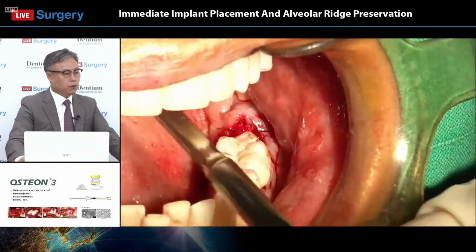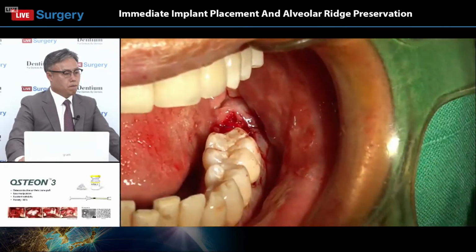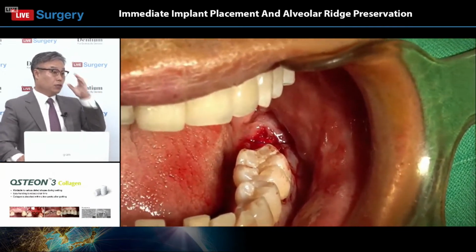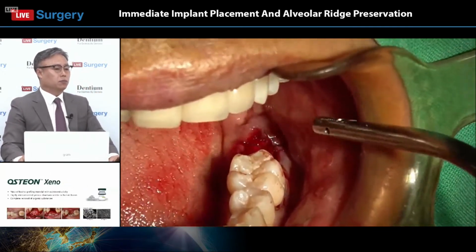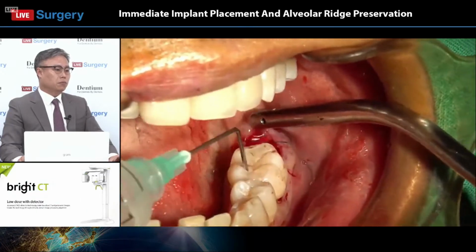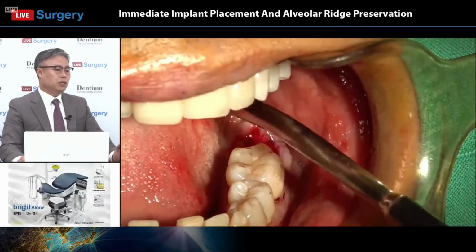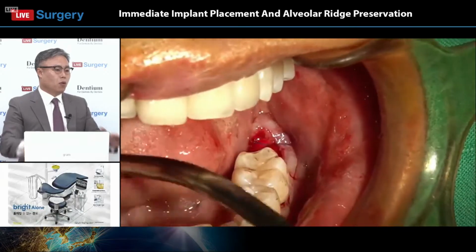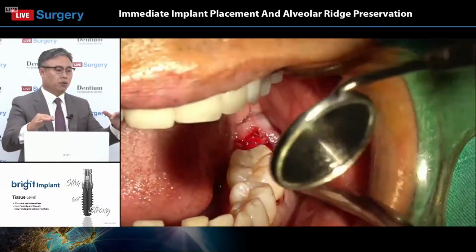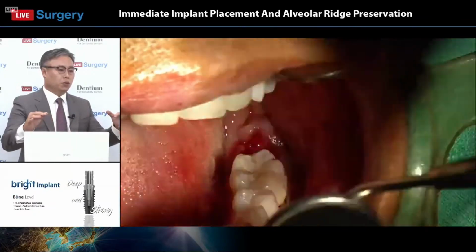As a precaution after extraction, I always tell the patient not to gargle and not to use too much mouthwash on that area. Sometimes, as I mentioned, this is very important. The bone graft material should stay in position for the early healing period, probably two or three weeks.